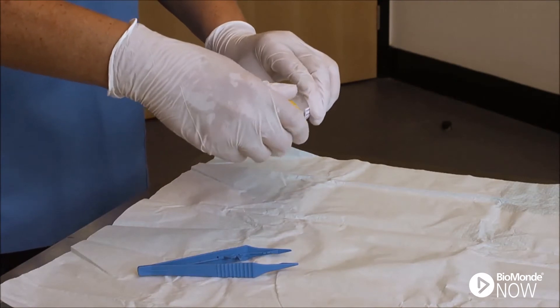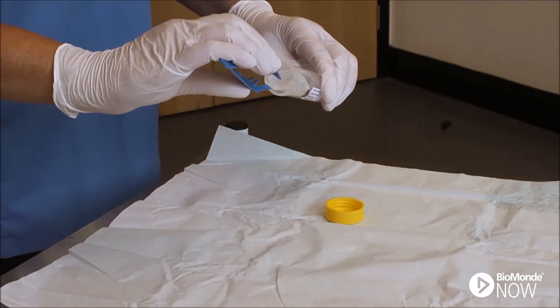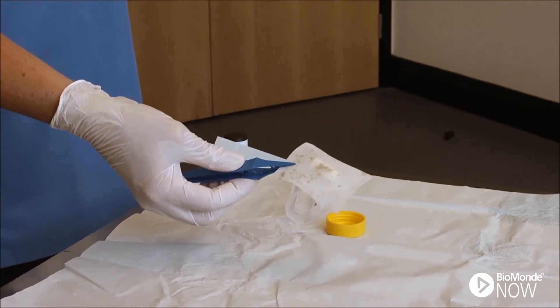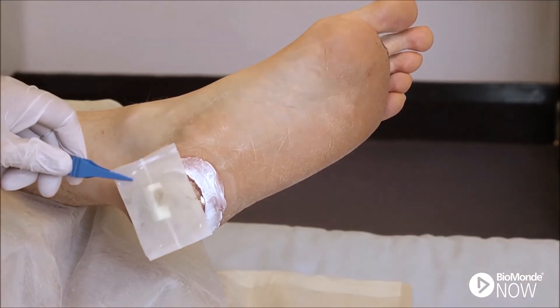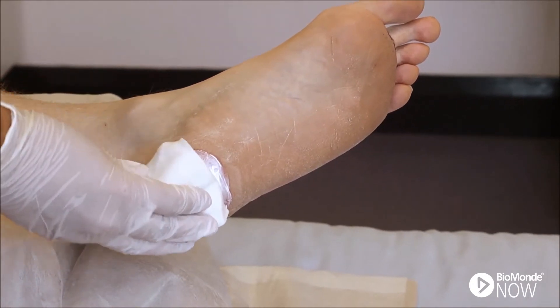Remove the bagged larvae from the vial. Check the larvae to ensure movement. Apply the bagged larvae to the wound, ensuring the bag is in direct contact with the wound bed and wound margins.